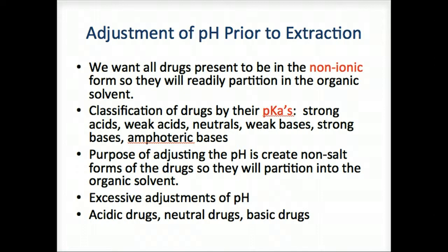The neutral fraction is difficult to analyze because glycerides, cholesterol, and cholesterol esters are recovered at the same time. The acid fraction is also contaminated with fatty acids, so removing of acids and neutrals prior to recovery of basic drugs results in a cleaner fraction. Let's take a look at figure 3.